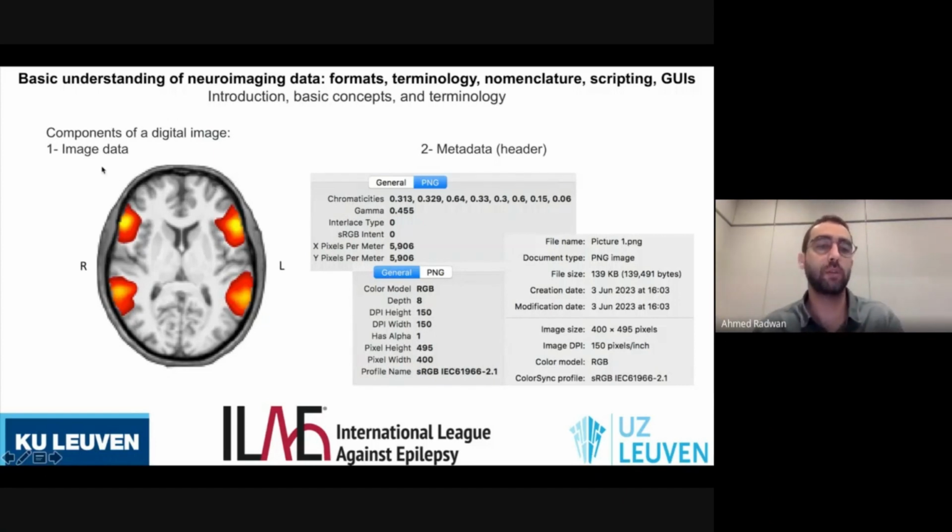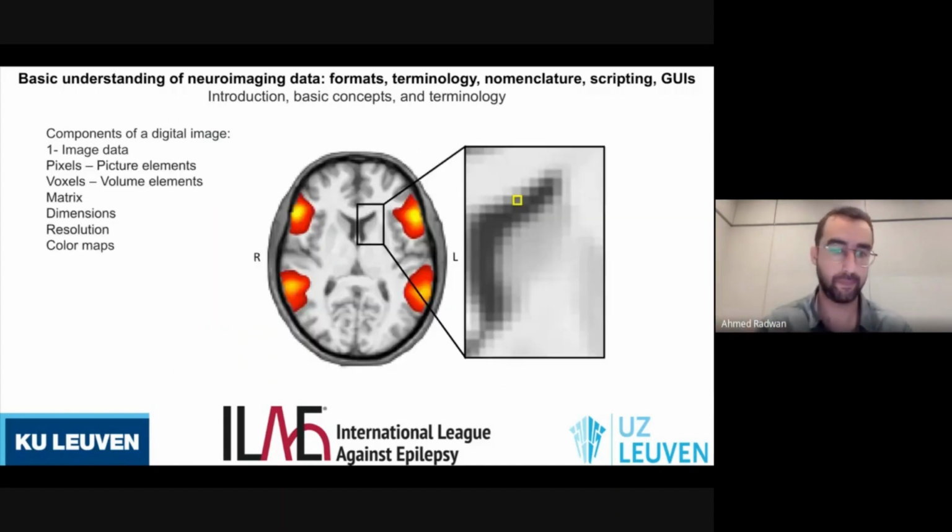It is actually a big table that includes as many elements or cells within it as there are elements in this picture. Each of them has a certain numerical value, and this is translated to an image using the header information or other back-end info, other info that you do not see visually.